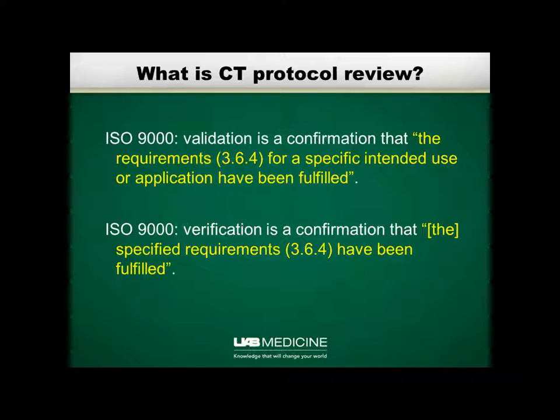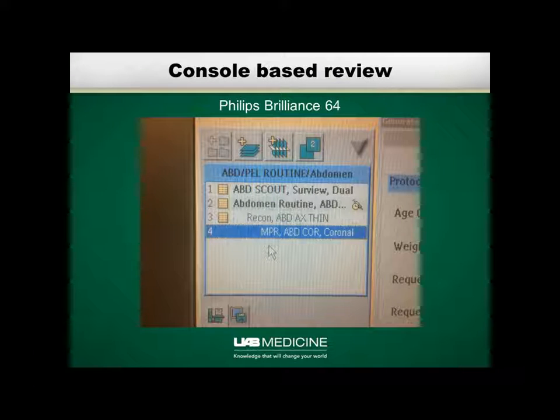So I'm going to be talking about various approaches you can follow to do both validation and verification. The first one of these is what I call console-based review. This is where you get a radiologist, technologist, and a physicist to sit at the console and start going through the protocols that are on the console.